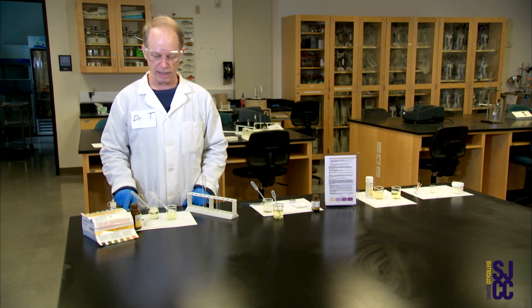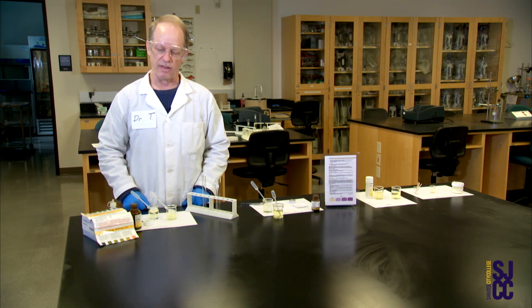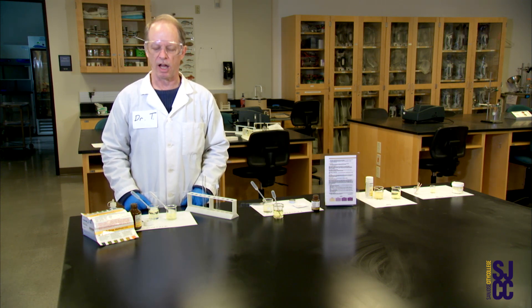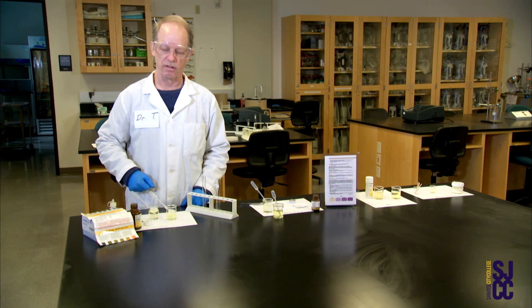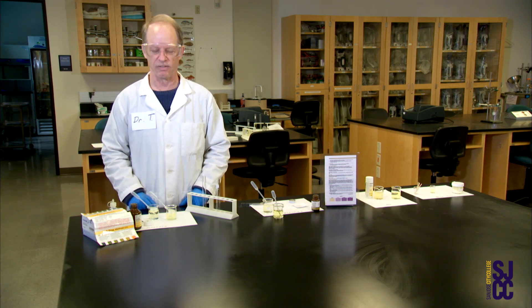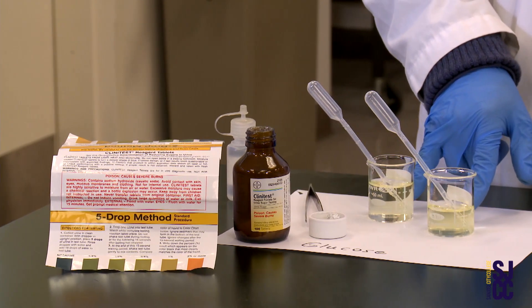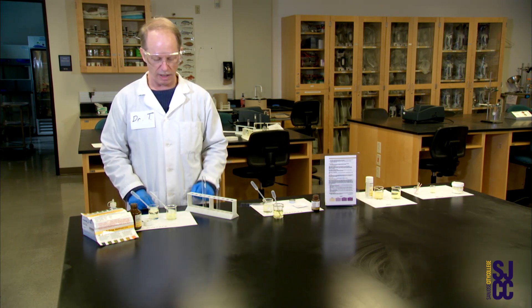In addition to my Clinatest tablets, I also have a color chart over here. The color chart is because this is a colorimetric test — it makes it easy to figure out how much sugar is in the urine, if any, by checking the colors and the numbers by the colors. That way you don't have to do any clinical chemistry if you're working in the back of a doctor's office. I have two different samples of urine, which I know what's in them and you don't, to show you the difference between a positive versus a negative result.